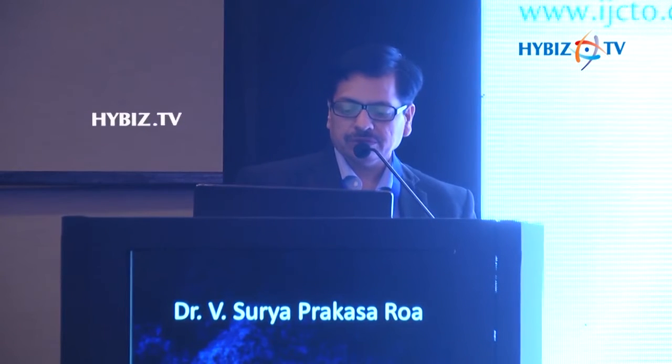Sasuke is more popular in Japan, and it is also not available with us. The main difference is that this is a 145 centimeter catheter, and there are no markers in this. You can find a visible tip, but there is no marker. I think most of the Japanese operators now are comfortable with the Sasuke. I haven't used the Sasuke personally in any of my cases. I have no experience with this.